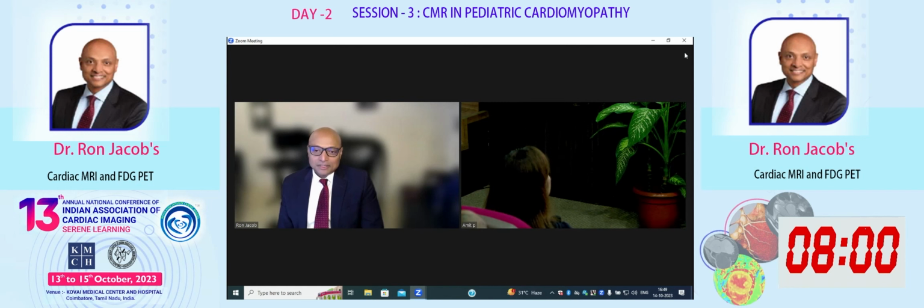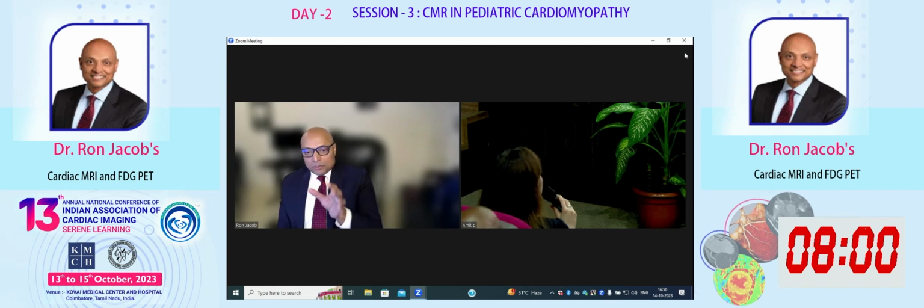Until you publish on changes in T1 and T2 that will help us guide therapy, there's more support in the literature for PET to guide therapy.